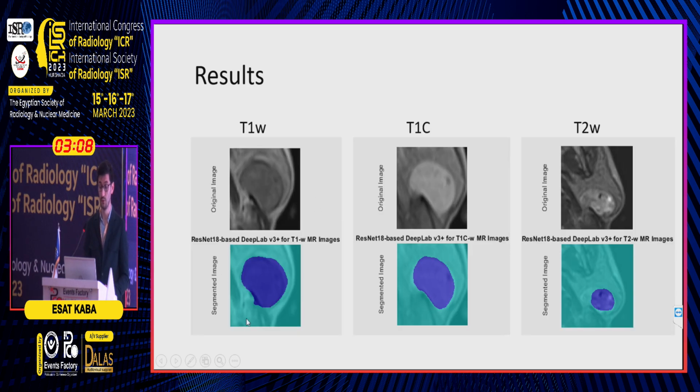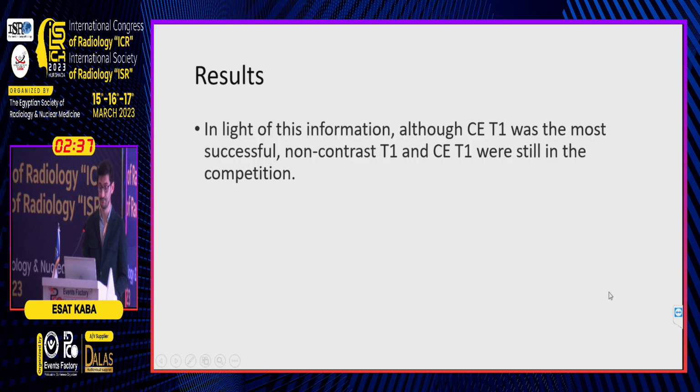These are examples of automatic segmentation from the deep learning architecture. You can see here left parotid gland tumors, T1 sequences tumors, and automatic segmentation from the deep learning architecture. Contrast-enhanced tumor and automatic segmentation, it seems very highly successful. And T2 images, left parotid gland tumors, with lower accuracy value, less successful T2 images.